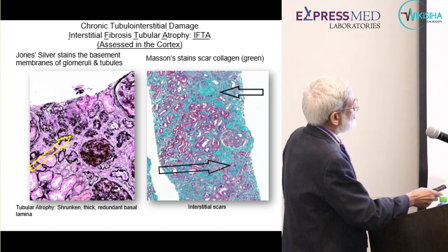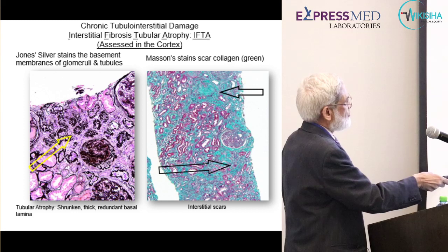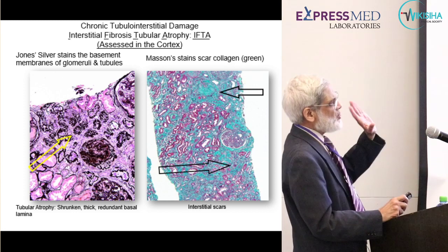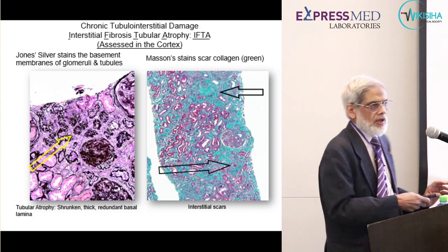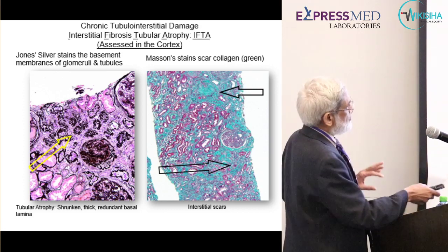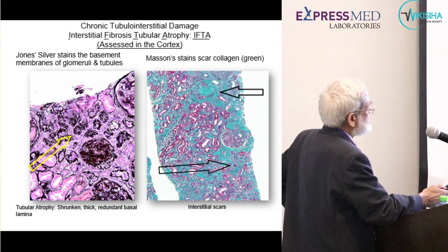It's also important to notice the type of scarring. Now here, the scarring is focal. So that's the focus of scarring here: an island of relatively preserved tissue and then another track of scarring. This usually suggests vascular etiology. This is the so-called striped fibrosis seen in cyclosporin A toxicity, where small vessels are affected. So that's striped fibrosis. Usually it means vascular etiology scarring.